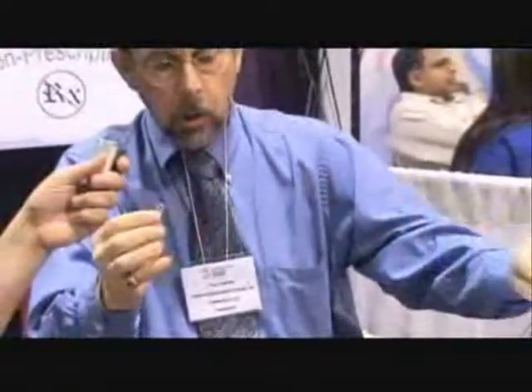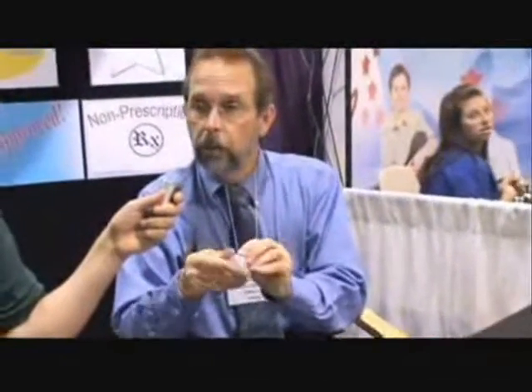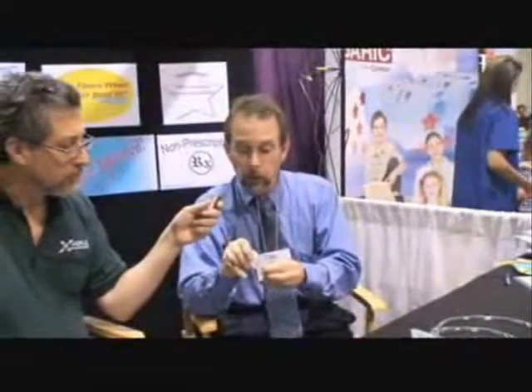This also provided an improvement to the dignity of an adult. A male that was wearing the catheter, that needed to go to the bathroom, didn't always have to be filling a bag. They literally can go into the restroom, stand at a urinal, disconnect the connector, go in the urinal, reconnect, and not have to worry about the connection coming apart.